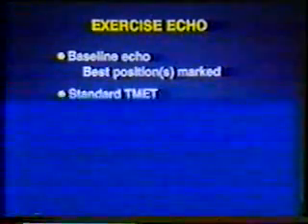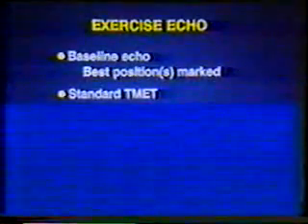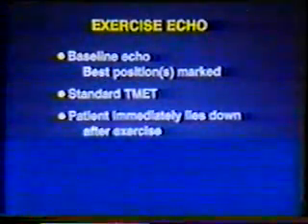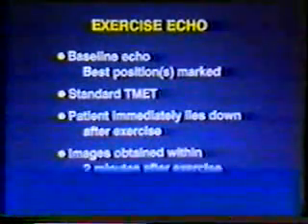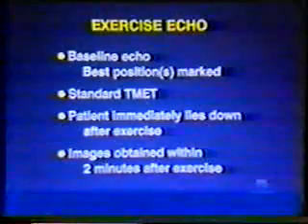The patient then performs a standard graded treadmill exercise test with continuous ECG monitoring. Once the patient has reached the appropriate endpoint, they immediately lie down in the left lateral decubitus position. Images of all ventricular segments are then obtained within 2 minutes of the completion of exercise.